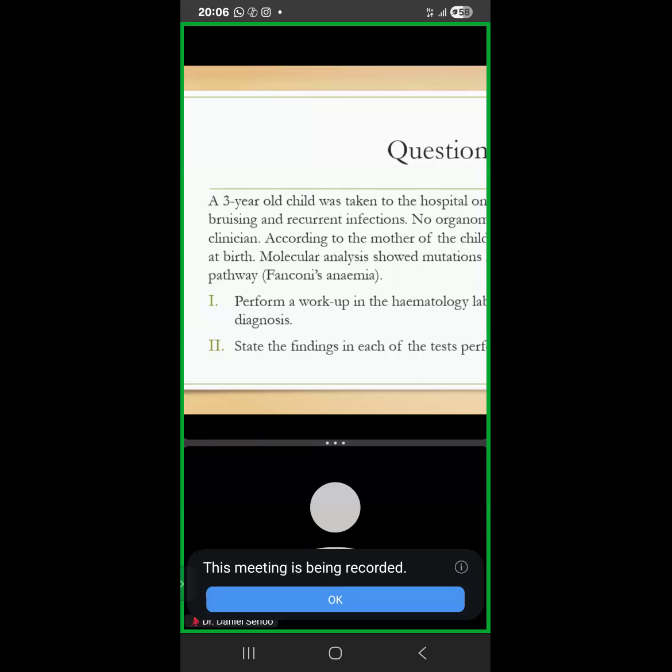Usually normal cells, except sometimes the red cell may be macrocytic. Apart from that, there will be no changes to the red cell. PNH, normal blood cells. Why? Because in PNH, destruction occurs in peripheral blood. Myelodysplastic syndrome.